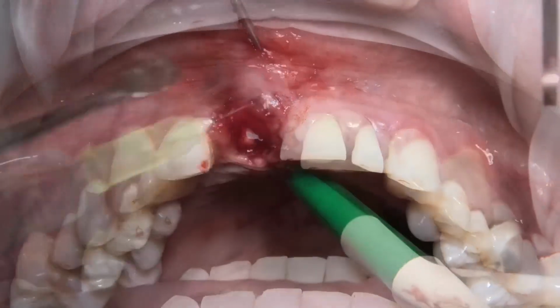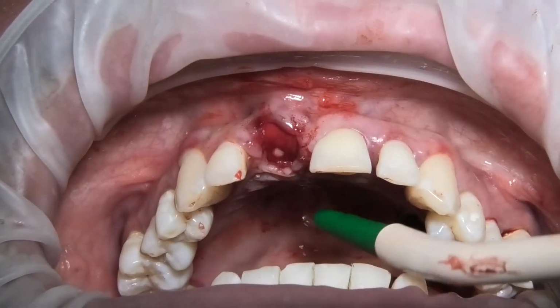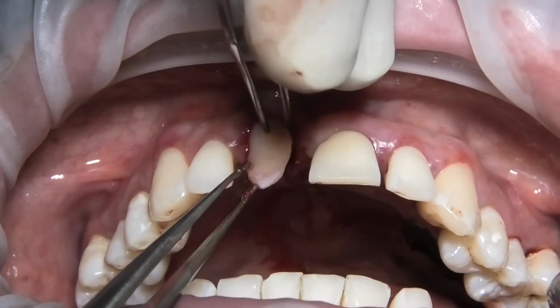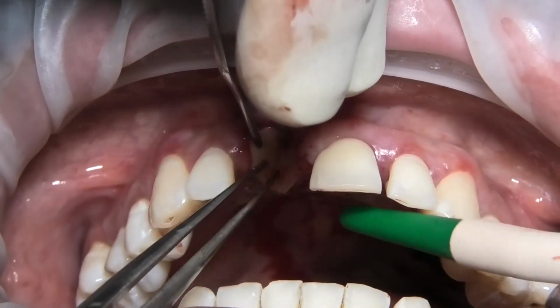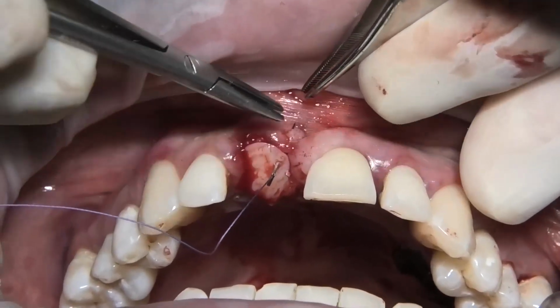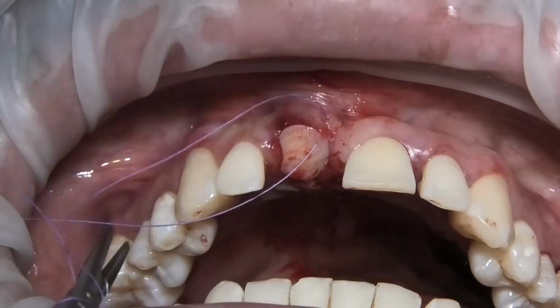second phase. Now we start to suture the punch with a 5-0 or 6-0 absorbable suture, and we position the graft after having de-epithelialized the margins with a scalpel 15C, and now starting to suture the ends of the punch with detached stitches. We start from the mesial vestibular angle, entering the graft and exiting the flap, and once blocked, with a little care, we go to suturing the opposite end of distopalatal.